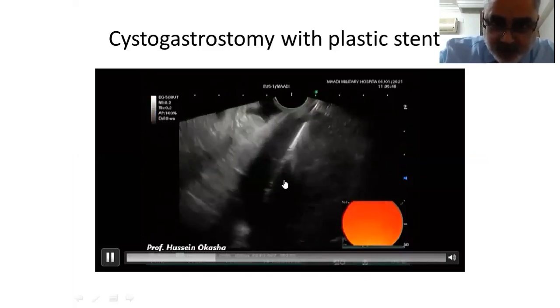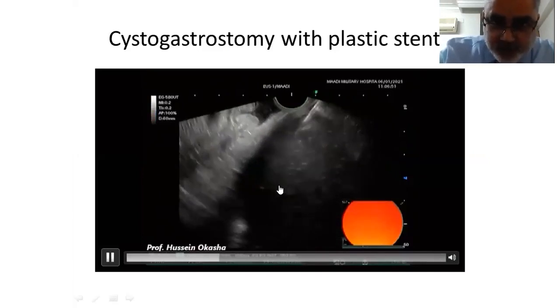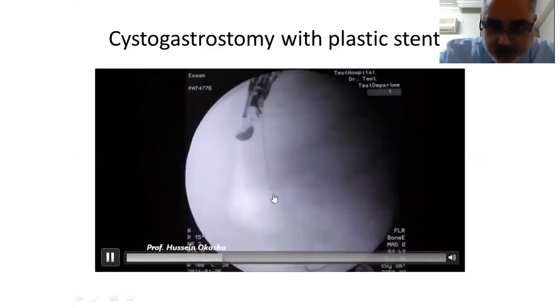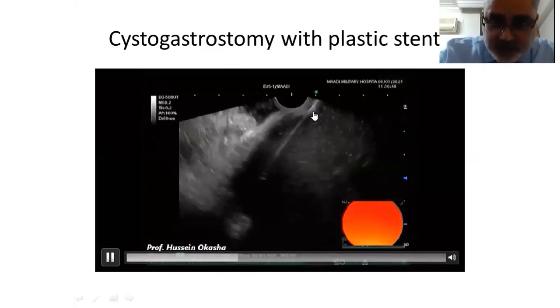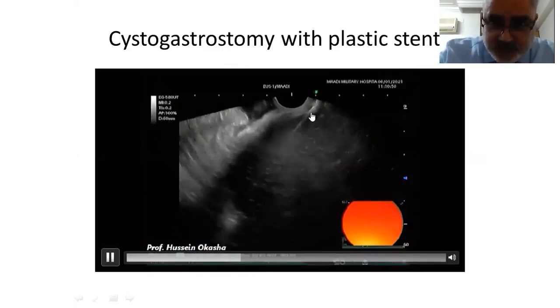0.035 wire. And by the screen, we can ensure that the wire is inside the cyst with at least 1.5 or 2 coils, and the wire should be straight. And then we introduce the 6 French cystotome. Here is the tip of the 6 French cystotome.